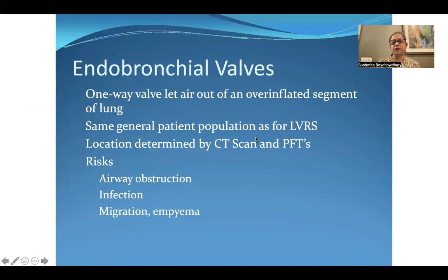Same general patient population that you would choose for lung volume reduction surgery, but not fit for major surgery. And by CT scan and PFT, you determine the location. The problem with them again is they can cause airway obstruction, distal pneumonia, infection, and the valves may migrate.